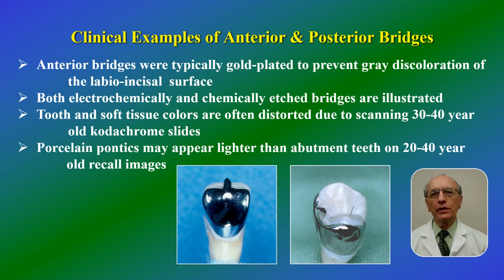Excuse the distorted color of teeth and soft tissues, as scanning of 30 to 40-year-old Kodachrome slides was not always successful. Porcelain pontics may appear lighter as adjacent natural teeth tend to discolor over decades, which also occurs with adjacent teeth to conventional porcelain or porcelain-fused-to-metal crowns.